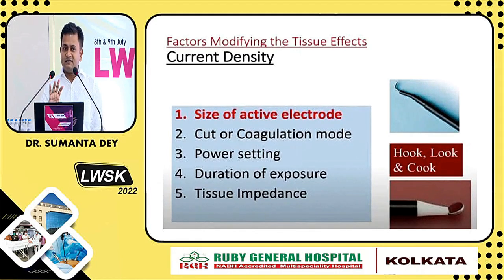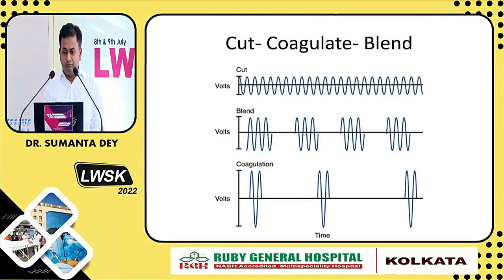And then again there is some confusion whether to use cutting mode or coagulation mode, but in most of the laparoscopic cases, we use coagulation mode in laparoscopic surgery. But you have to understand why we are using coagulation and why not cutting.